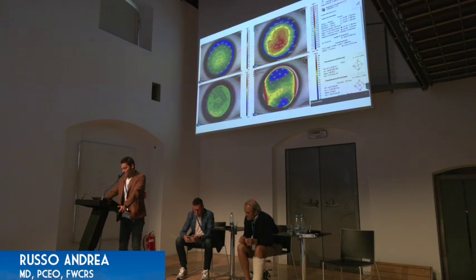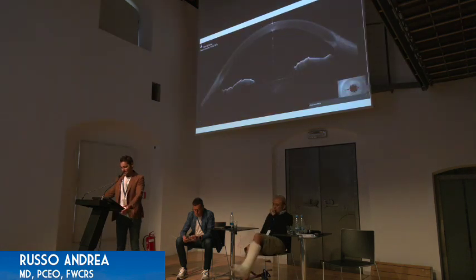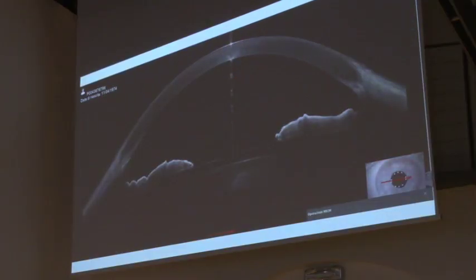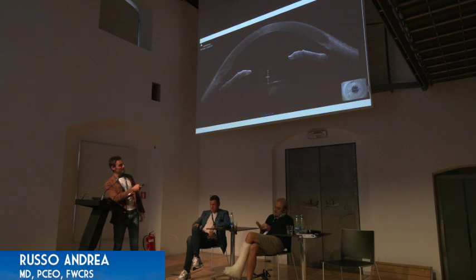And you can tell from these cases, so this is keratoconic eyes, both eyes. And of course, the vaulting was zero, as you can see here, because this is a huge anterior chamber. So we decided to get a new ICL 2 steps bigger, and this is the result after the surgery. So once again, what is important is not the number that you read here, which is 850, but the angle, which is now a very nice angle.